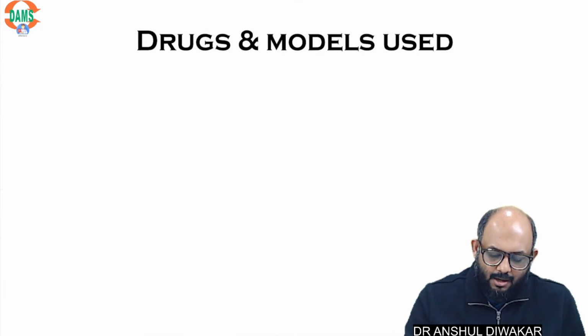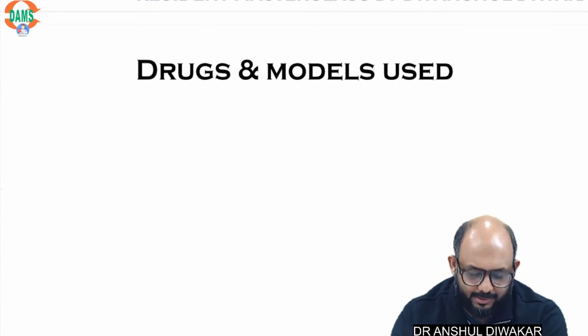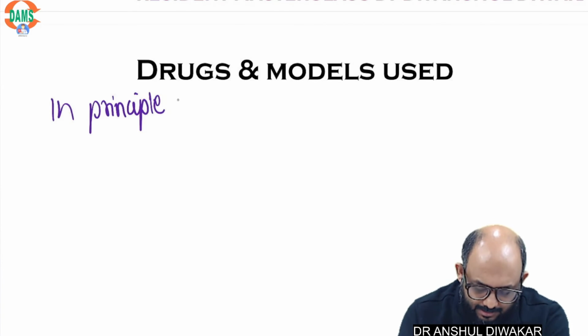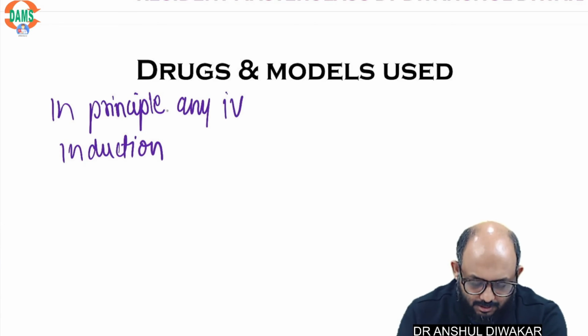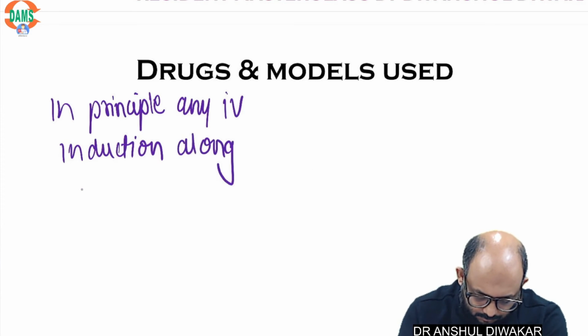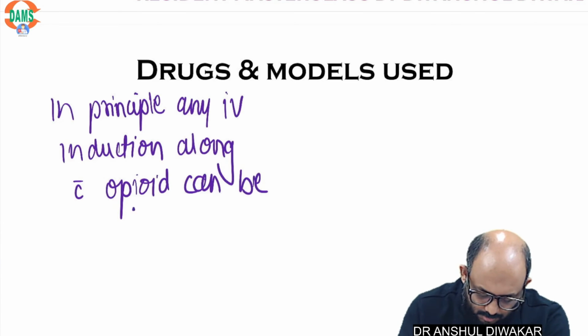Let's look at the drugs and the models used. Now, I'm not going into too much detail of these things. In principle, any IV induction agent along with opioid can be used.